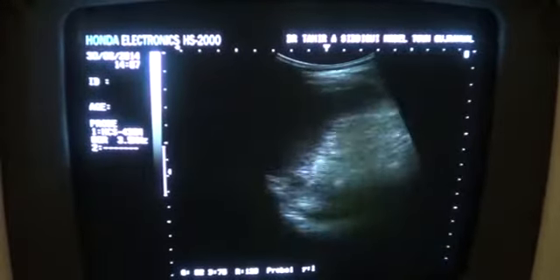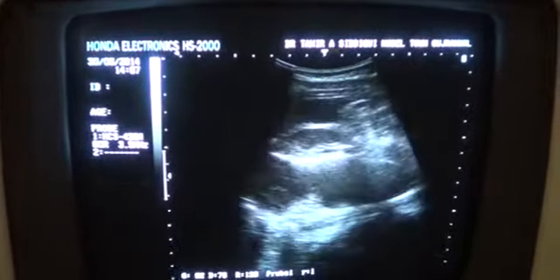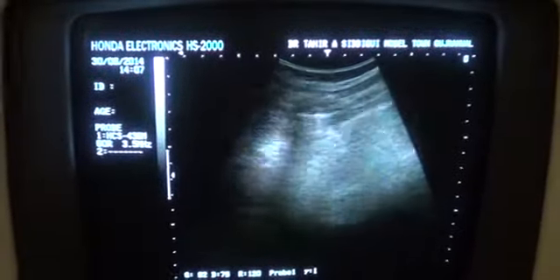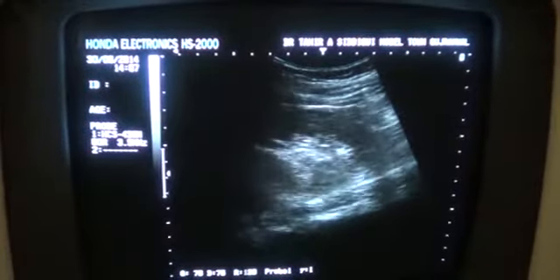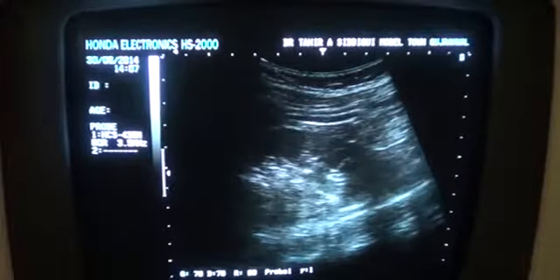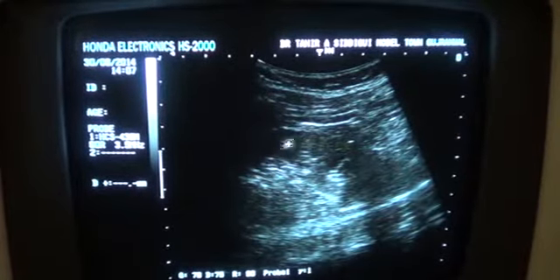This is the spleen in front of you. Now, left diaphragm; the spleen is normal in diameter. Now this is the left kidney. At present I am focusing on the lower pole and the mid region of the kidney. This is the lower pole, this is the mid region.